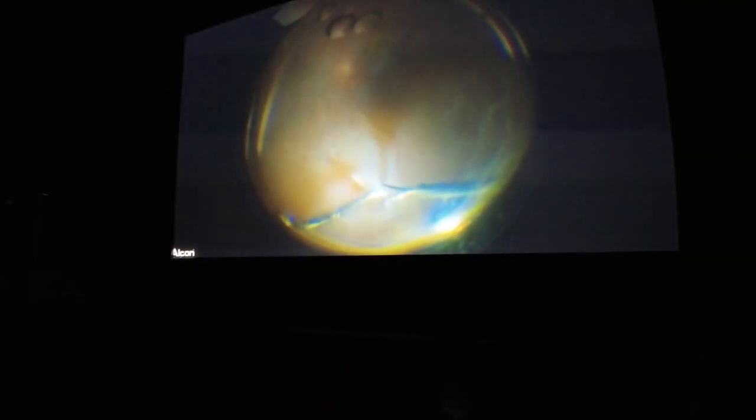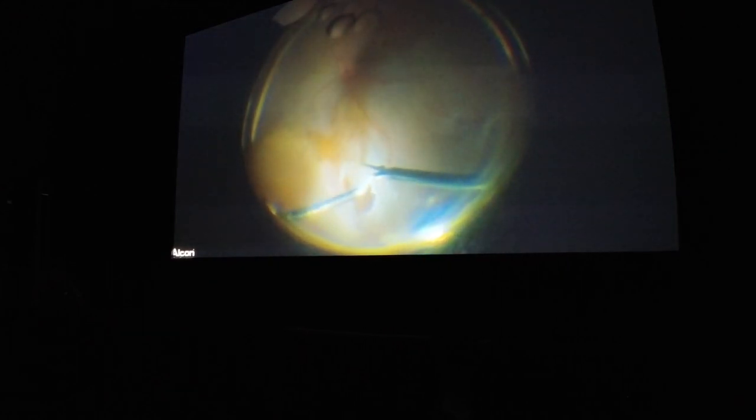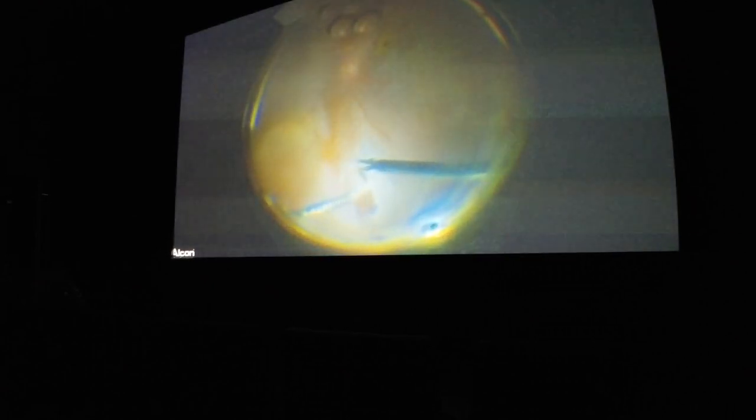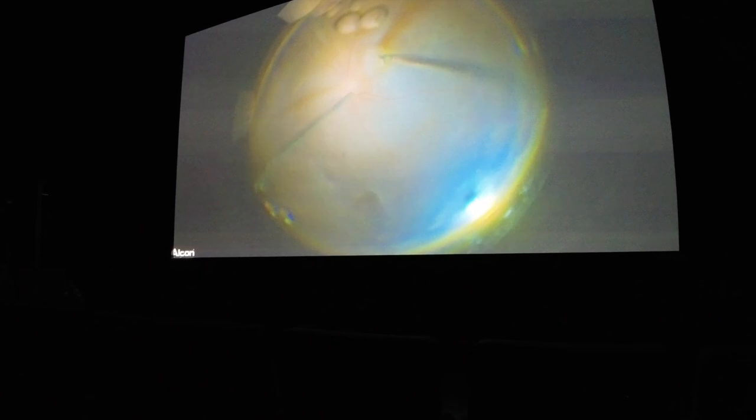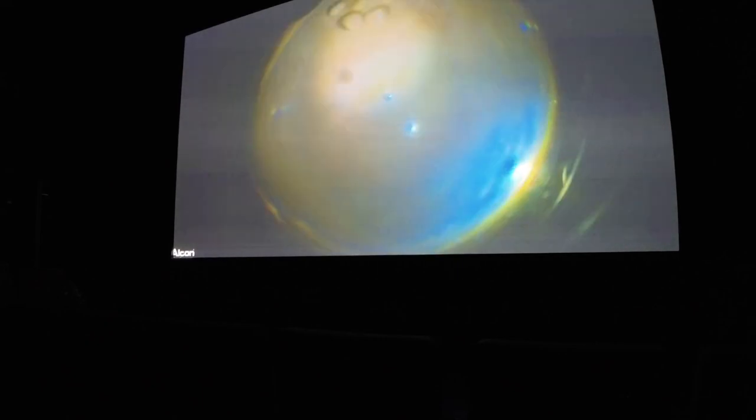This is an example of a retinal autograft procedure in retinal detachment due to a large macular hole — normally occurring in high myopic eyes. The only solution for such retinal detachment is to close the macular hole; otherwise laser is pointless and cannot be used in the macula. It can be done with autograft, amnion membrane, or ILM flap — but here I choose retinal autograft. With Ingenuity, the freedom of movement is far better than if I were inclined toward the oculars of the microscope. Here I will readjust the position of the graft, and that's it.